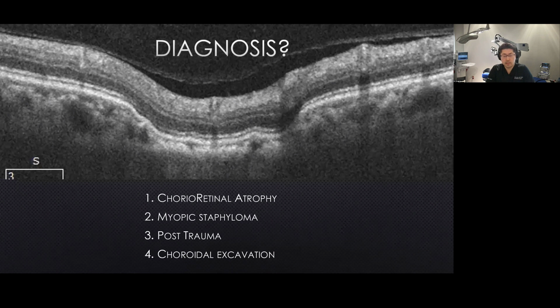We don't have just access to OCT, we have OCT angiography, fluorescein angiography, ICG, Optos, autofluorescence, B-scan, A-scan, and various imaging modalities. So it is really fun and a good time to practice medicine for the eye. So yeah, this is great. Also distributed between 1, 2, and 3.